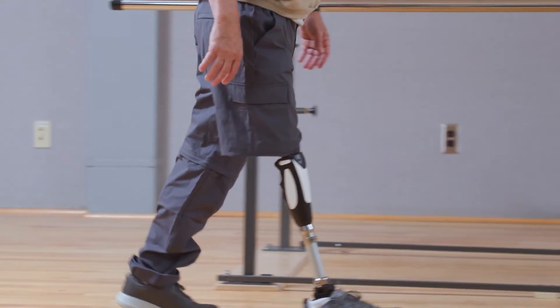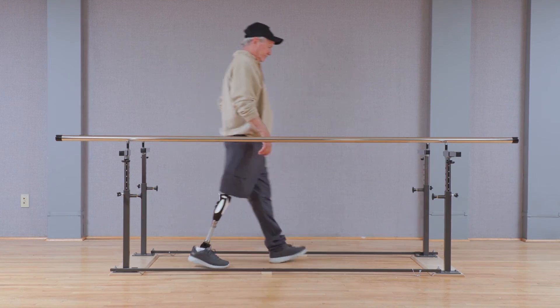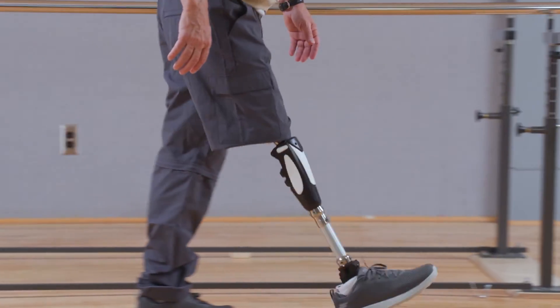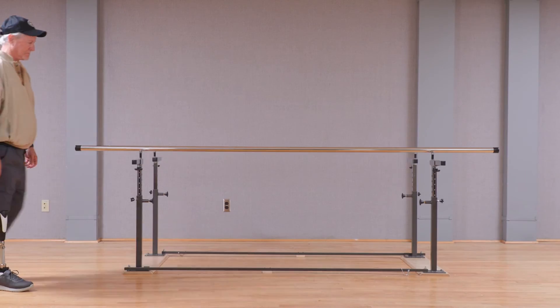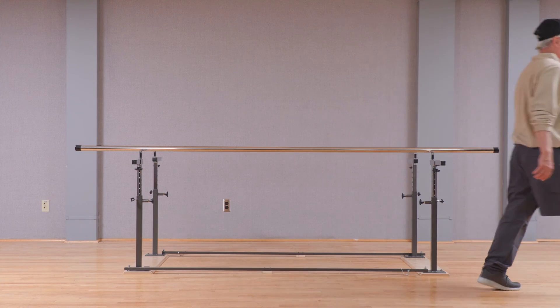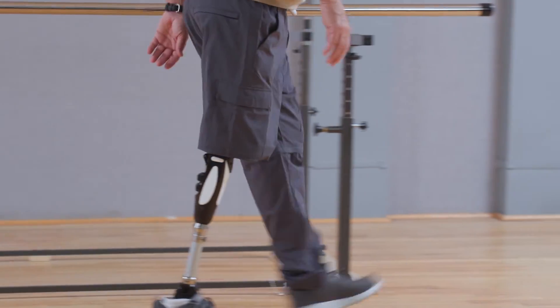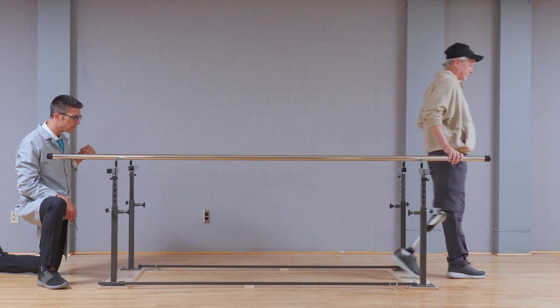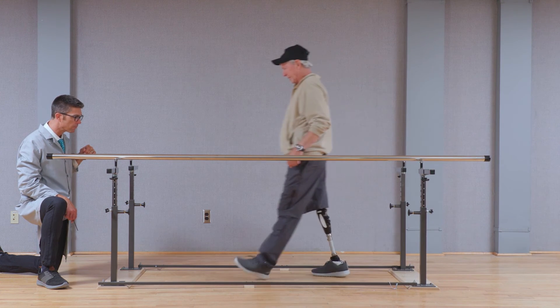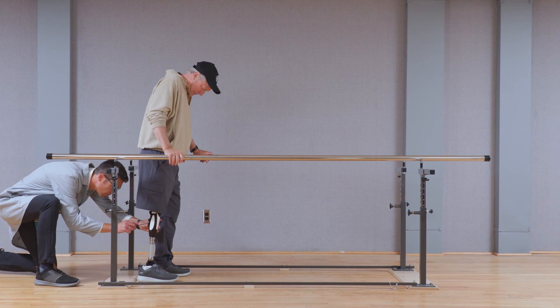Once the stance trigger resistance is optimized according to the user's needs, the knee should trigger into swing at the appropriate time and the transition from stance to swing phase should be seamless. Once the swing settings have been optimized, have the user ambulate outside of the parallel bars, making sure the settings are appropriate for varying speeds and step lengths. Ensure that they ambulate at self-selected, fast, and slow pace to double-check the appropriateness of the swing settings, and make any fine-tuning adjustments as needed.